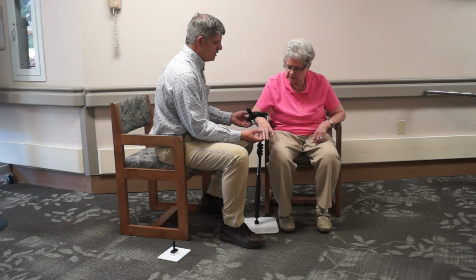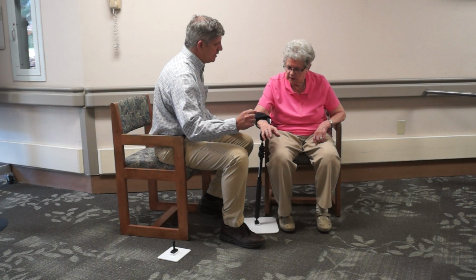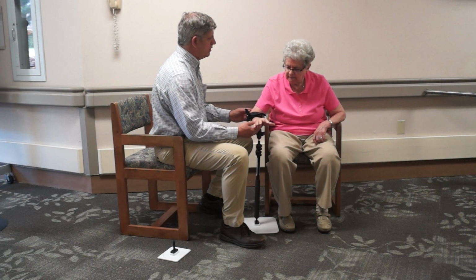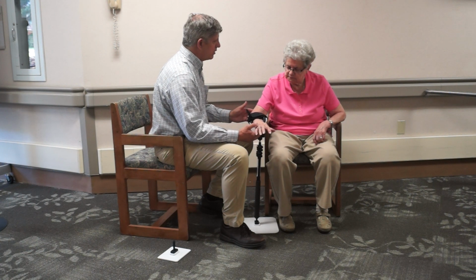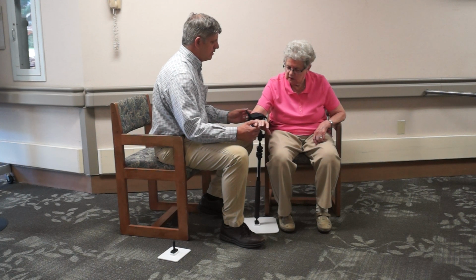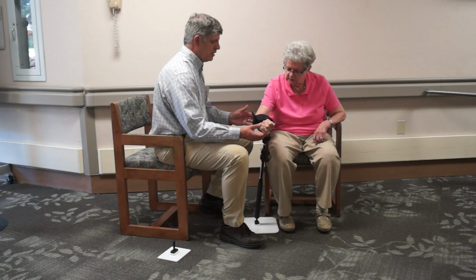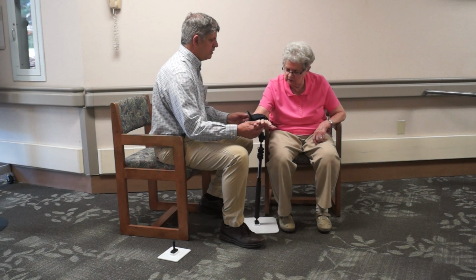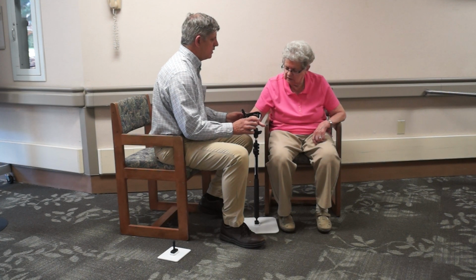And then what we'll eventually do is use some objects to grab, so your hand's free, but you don't have to support the weight of your arm. So we can do more repetitions to help you get stronger. As you're reaching out, you can just act like you're grabbing, and then come back. So each time, act like you're grabbing, and then let go. Relax on the way back. So just reach out like you're going to grab something, and then come back and just let go.